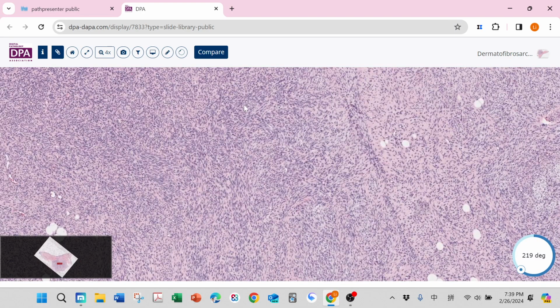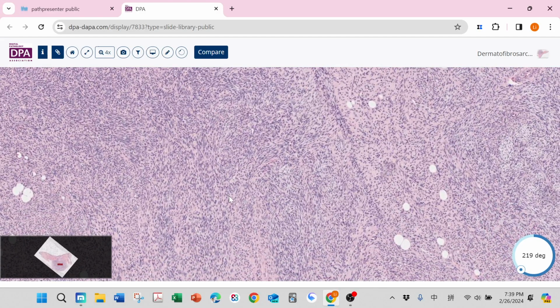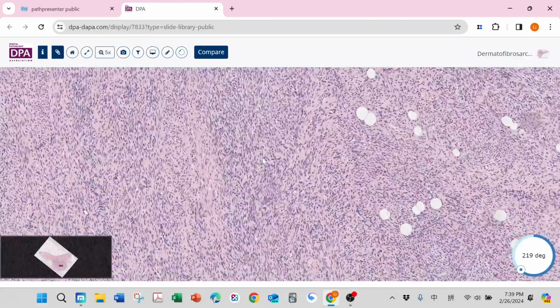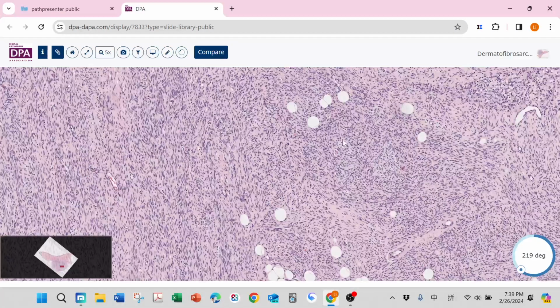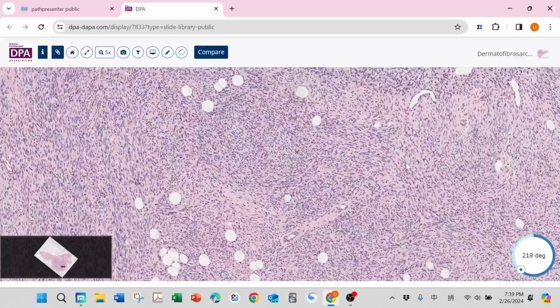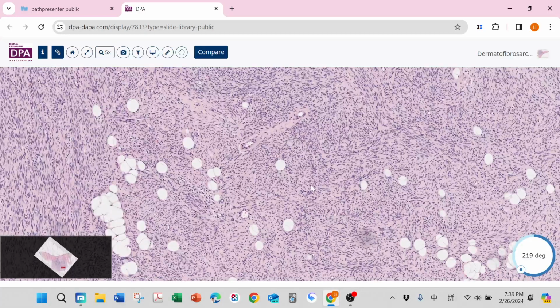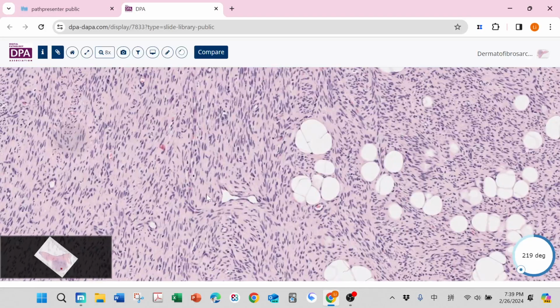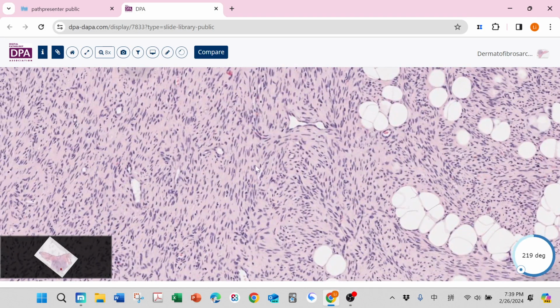We can see this kind of fascicular growth, almost like herringbone. If you see really long fascicular growth and herringbone pattern, the DFSP is suspicious for sarcomatous transformation. But for this one, you can see short fascicles, and then I think it would be classic to find some swirling growth pattern. But when you see the cytology, the cells are still really bland. They're not like really high grade cells.